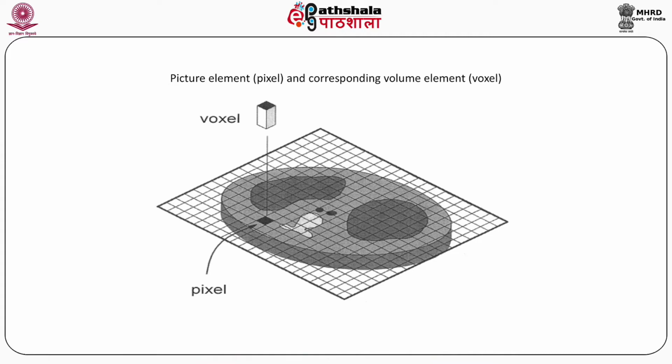In this case, I will tell you about the basic principles of CT image, describe different image reconstruction techniques, and explain about different generations of CT scanners.